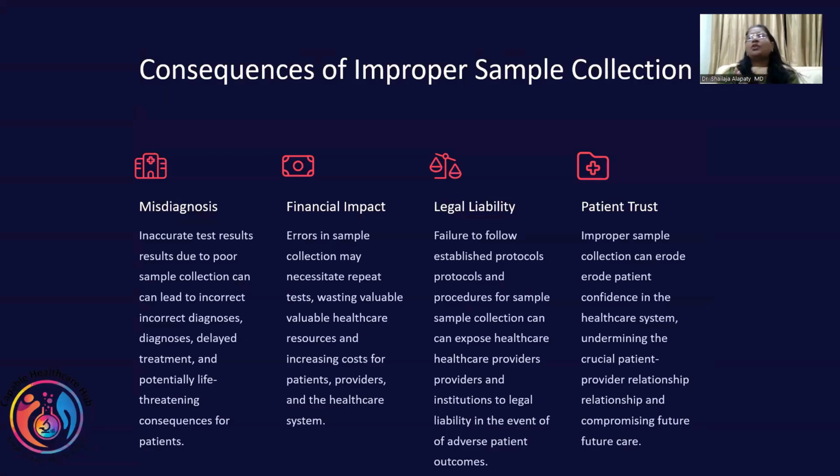And if all this is not okay, you have the consequences of misdiagnosis. 100% wrong report, 100% it is wrong. Plus, the patient, instead of getting better in 2 days, will take a longer time because he's not getting treated for the value which is inside his body. And then we have to repeat the test. Again, he has to pay for it. Legal liability is now coming in. But most important, if a patient comes to our hospital and doesn't get the right treatment, he's not going to come back again.